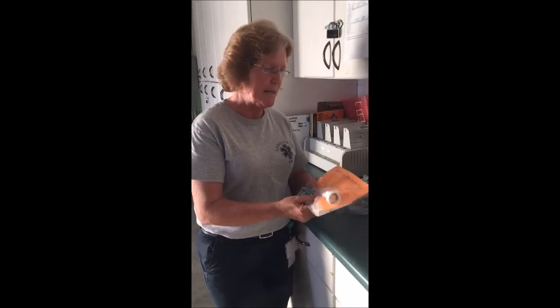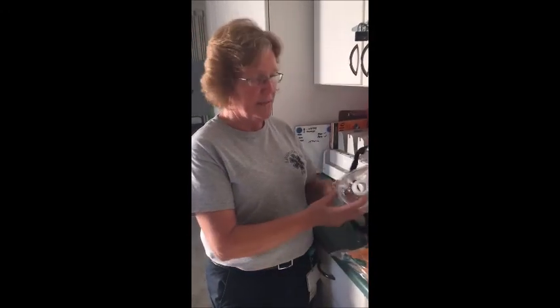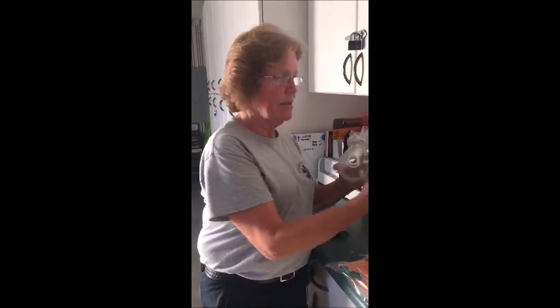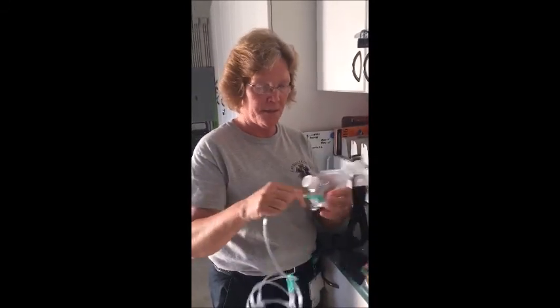So, addendum to the CPAP video that you watched, the trio control unit that they talked about, we will not be using this unit. This is the one that increased the FiO2 from 30 to 60 to 90%. We will, however, be using the tab on the front of this mask if you have a patient that is not maintaining an O2 sat of 95%. You can pull one of these tabs off the front of this, attach additional O2 tubing to the front of this, and to a secondary oxygen supply in the truck, so that you maintain the O2 sat at 95%.